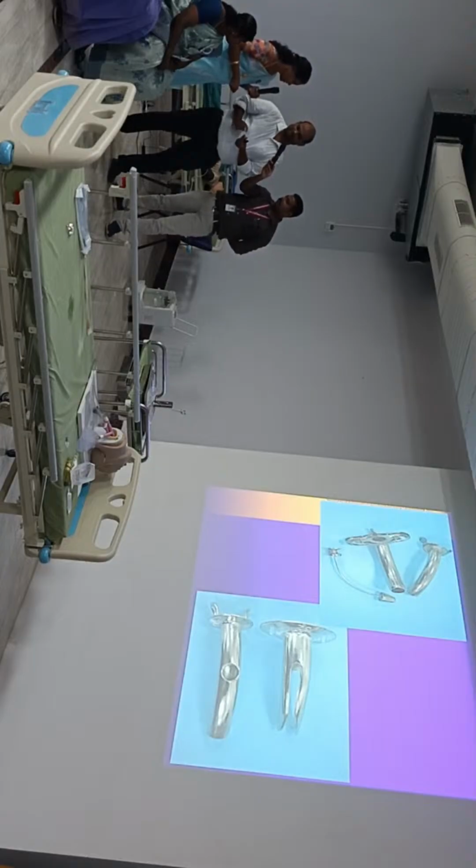Two flanges here. Yes. You can see two flanges here, one fenestration here, and the inner cannula here. What other thing else can you see here, compared to that tube?